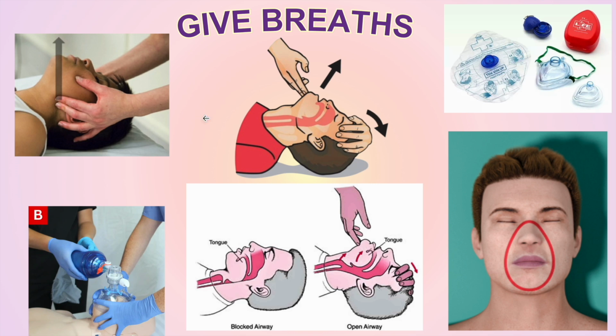When multiple rescuers are available, one rescuer can perform a jaw thrust, while another rescuer provides breaths with a bag mask device, as you can see in this image. The third rescuer will give chest compressions.